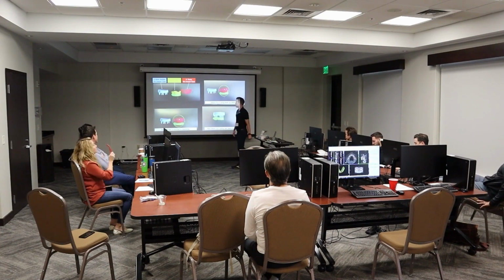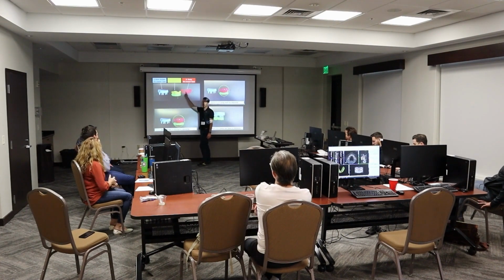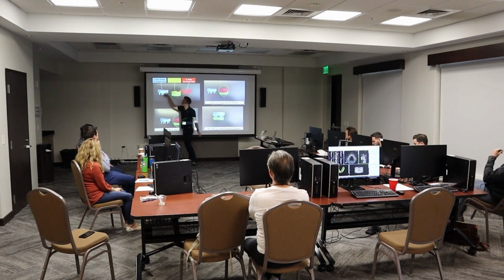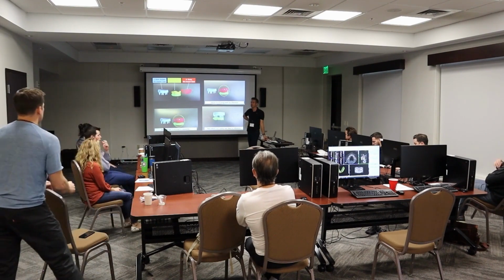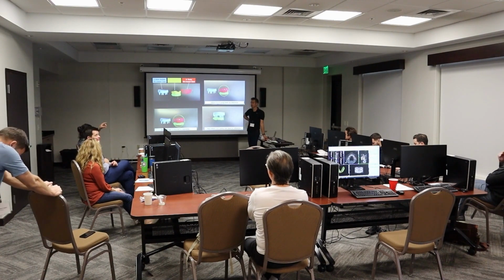And the key aspects here really came down to this, because that temporary on the master cast, where you had some stone references, is how this one got to match up to that one, because those stone references are the commonality. Those are the stitching points. And now they can actually bring in that stone into occlusion and do a full design. I mean, that's all the lab needs, and now you're going to get your final back, right?